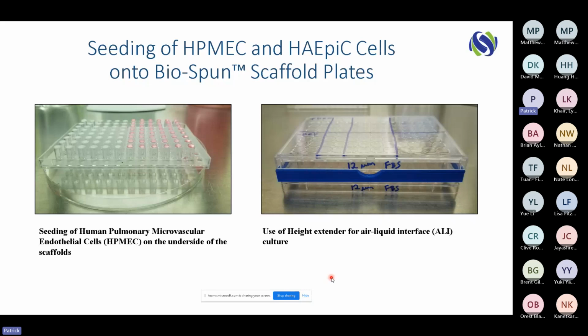And we have a different way of using this hanging top, which I'm not going to really show here, or it can be used if you have individual inserts and you need to raise those up to do air-liquid interface culture.